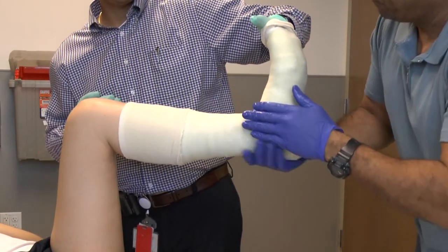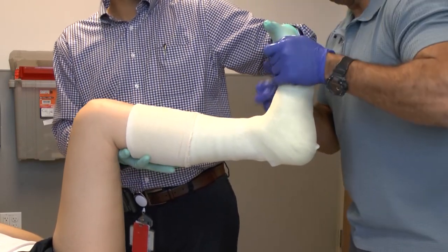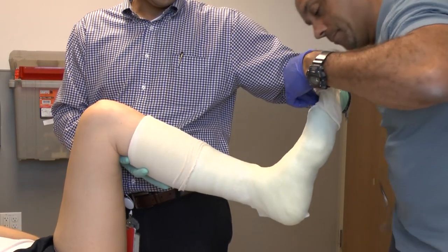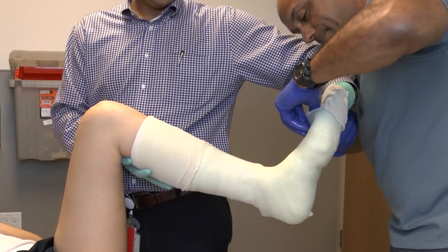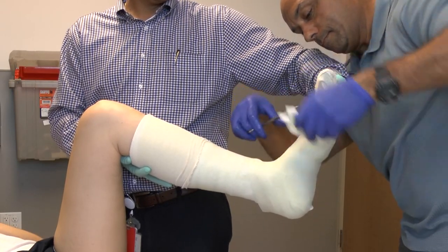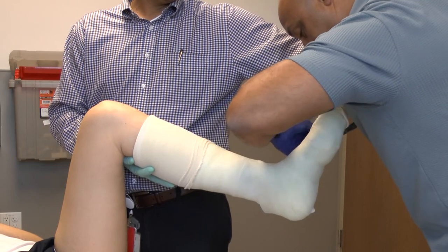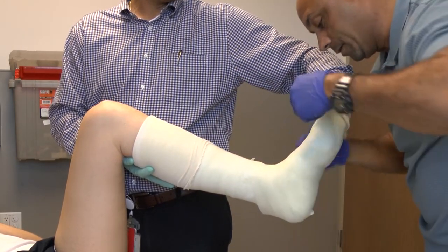Once the reinforcing splint is done around the foot, we pull the stockinette down past the toes. You'll need to cut out the dorsal portion so that you can see the top of the toes, which is important for checking compartment syndrome and swelling. The stockinette will then get pulled down over the top, and you'll have a better visualization of what this looks like at the end of the video.